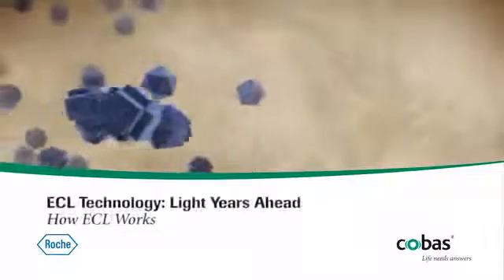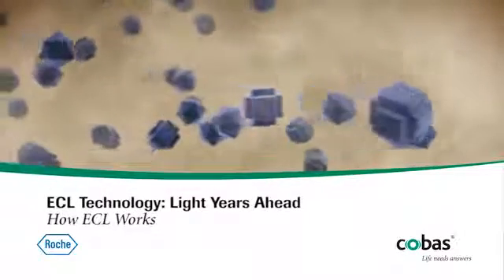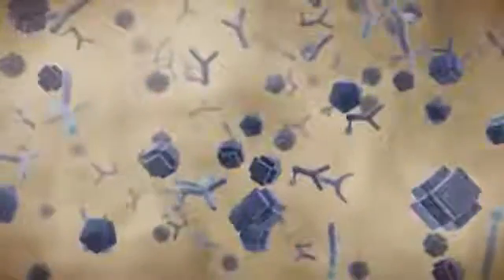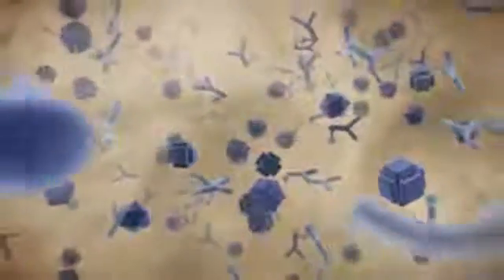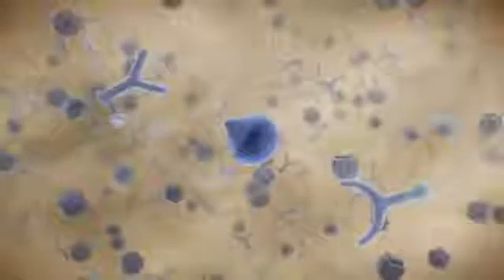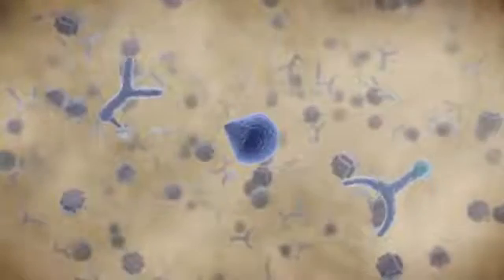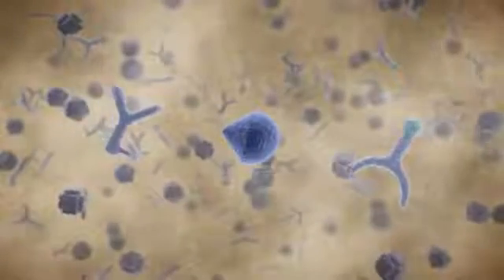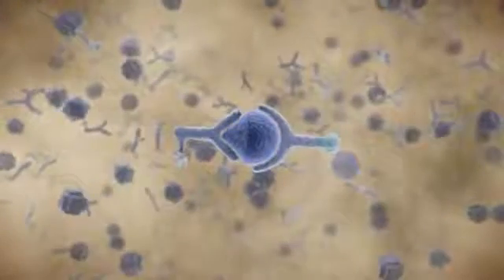In immunoassay detection, carryover-free disposable tips are used to pipette a patient sample into a disposable cup. Incubation with two antibodies begins. The first antibody is labeled with biotin, the second is labeled with ruthenium. Both are highly specific to binding sites on the target antigen.